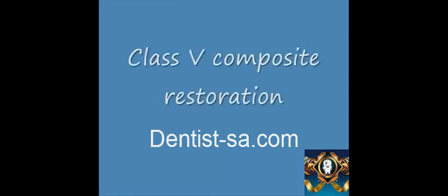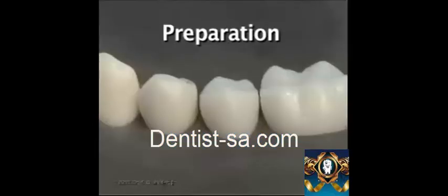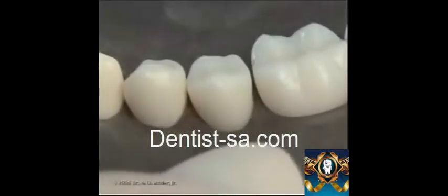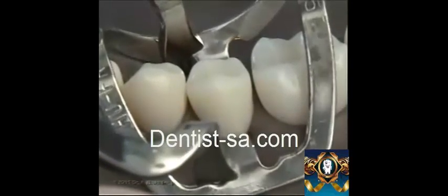Class 5 composite restoration occurs on the cervical region of anterior and posterior teeth. This preparation and restoration requires application of a cervical rubber dam and retainer to provide additional retraction of the gingiva. The retainer has been applied carefully onto the tooth surface.